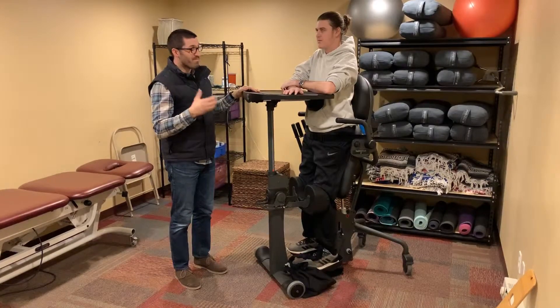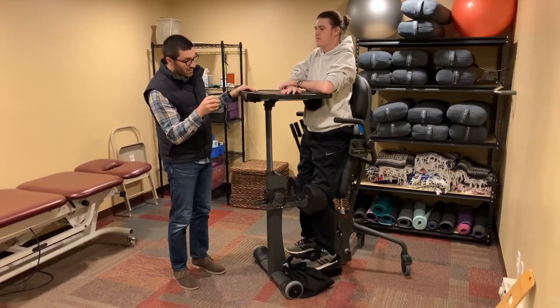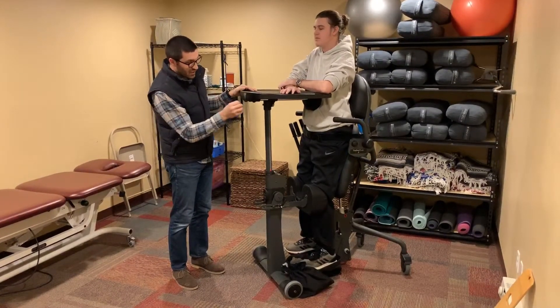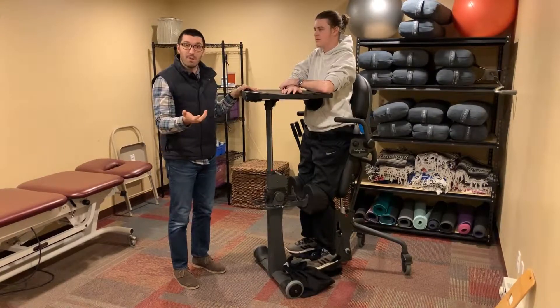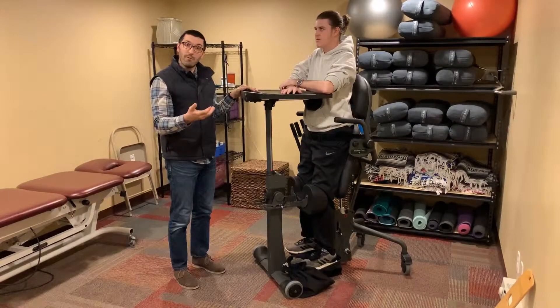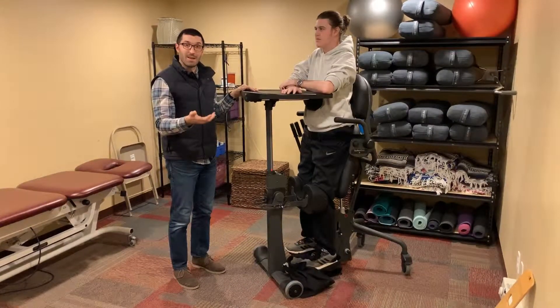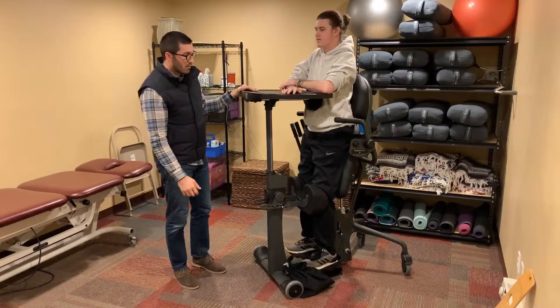Honestly, using electrical stimulation in conjunction with standing is probably the best way to help improve or maintain bone density in the long run.